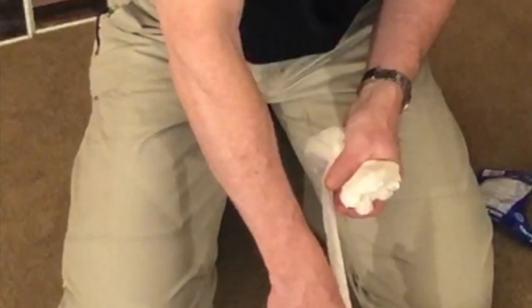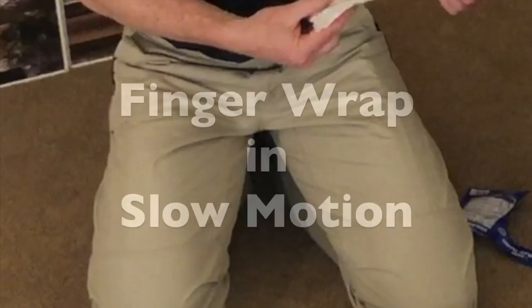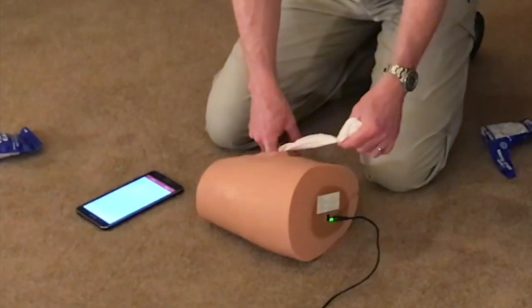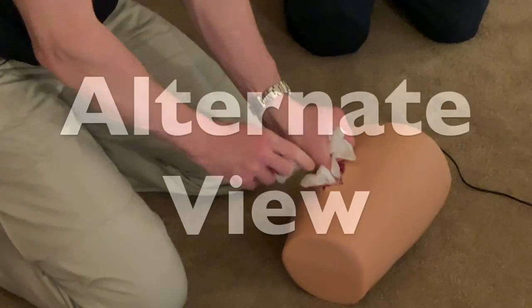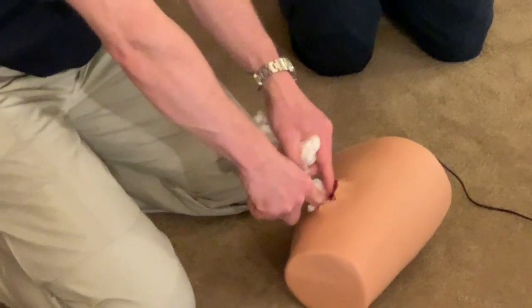Let's break this down. Mike has identified where the bleeding source is, put his finger in the wound, got his gauze ready, and then wraps it around the tip of his finger using training combat gauze. Next, start feeding into the wound — one hand packs, one hand feeds. Extend out about six to eight inches, then feed it to yourself. As soon as your finger comes out, push that in, then feed a similar length and push it in — so you're almost always in the wound and keeping pressure.